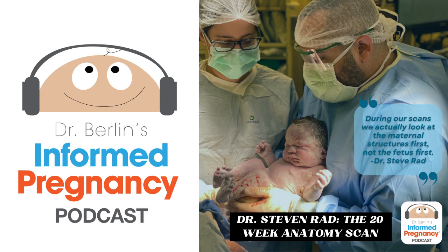What's the benefit of a full bladder for ultrasound? So if the bladder is full, you can see the cervix or placenta location or certain structures a little bit better. A full bladder sometimes affects the position of the baby. If the bladder is empty, there's a lot more room for the baby to move. If the bladder is full, maybe the baby is more likely to stay in a specific position, so you have more time to look at the spine, for example. But if you can only see the spine, you can't see the face or heart because the baby's looking down and showing its spine up top.